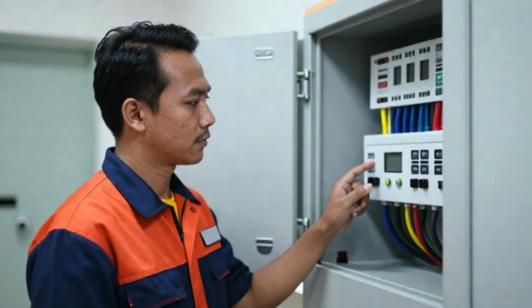These tests may include checking earth resistance, measuring leakage current, and inspecting cables and connectors. Preventive maintenance helps identify potential problems before they cause accidents or equipment failure.